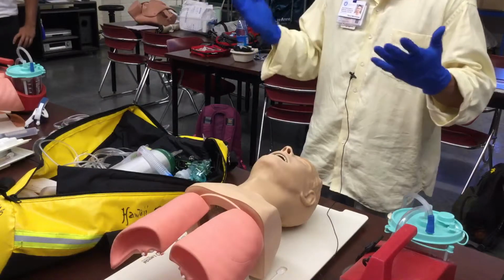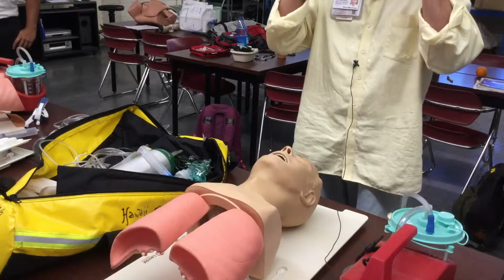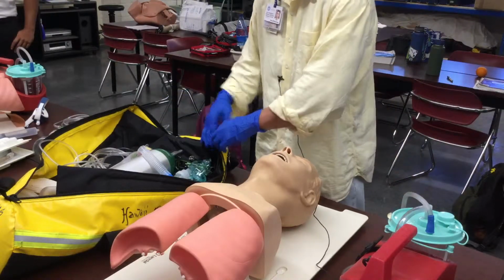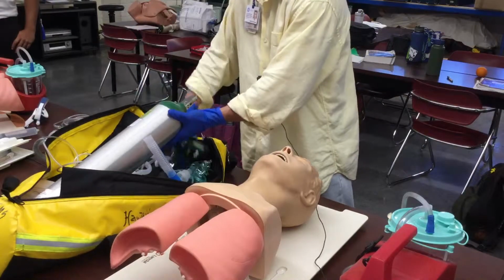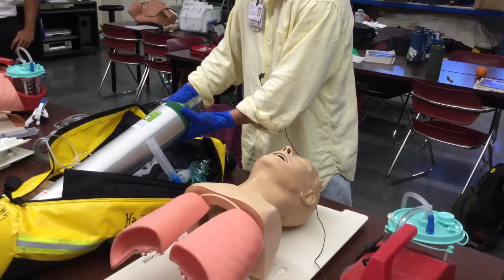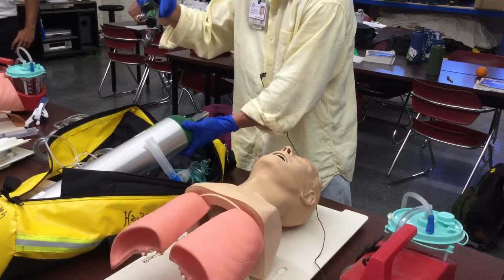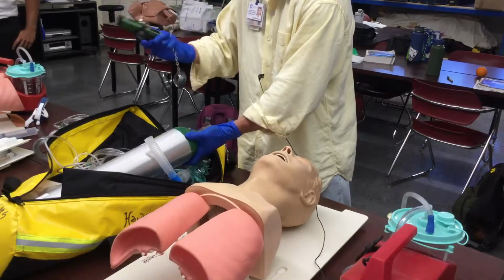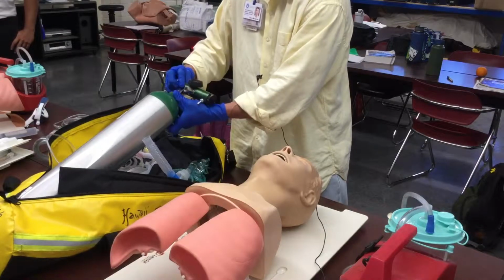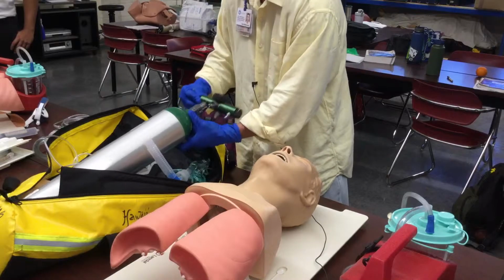And then we would say something like scene safe, but mostly BSI, PPE, so mask, face shield, and gloves because I'm dealing with the airway. So I've got to check out my equipment, make sure my tank is operable. The color scheme is green, oxidizer placard. I have my oxygen regulator assembly, my pressure gauge, a flow meter, and I have the yoke on top. It lines up with a pin index system. There's a washer in place, and I line this up to make sure that it all fits.